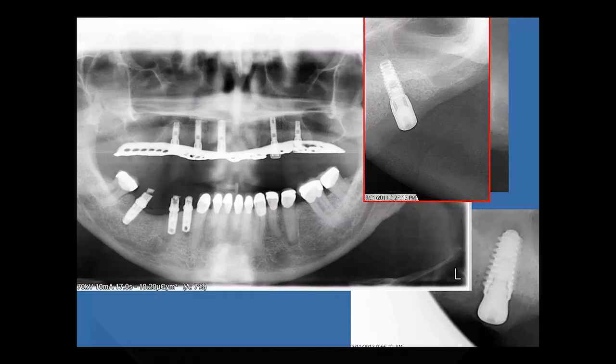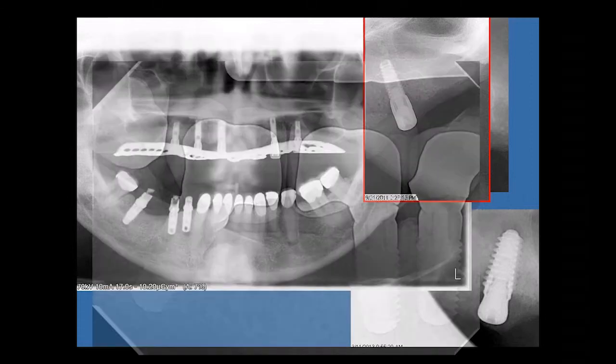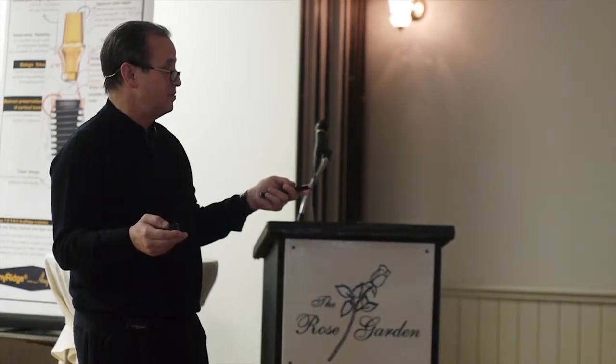So now he's got his original palateless overdenture. As I mentioned, we lost integration here. Here's the implant that we used to replace it. This has a much better prognosis than this ever would have. And this was a screw-up because we should have made a fixed bridge down here. So this actually came loose. We had to unscrew it, go back and make another crown. But other than that, the case has done really well.